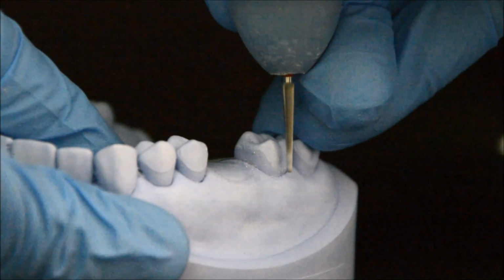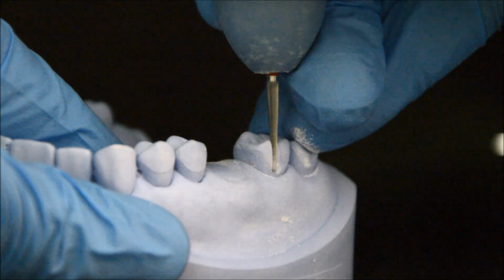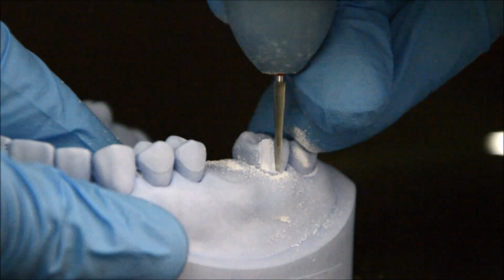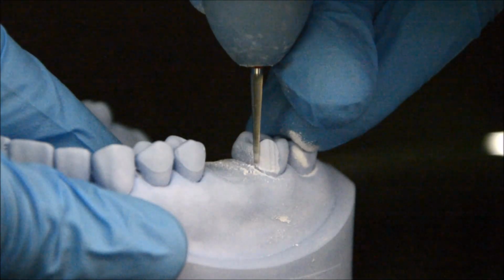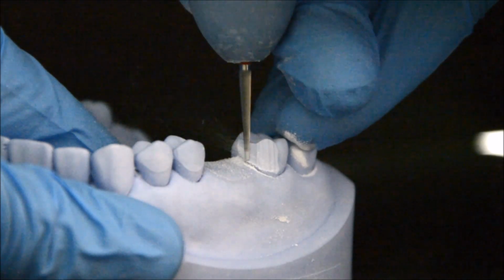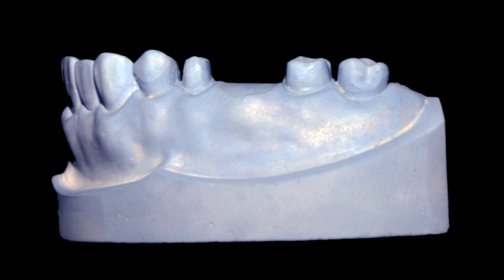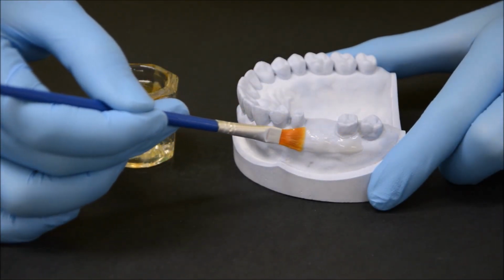The abutment teeth on the cast are then trimmed using a low-speed handpiece and a thin burr. This provides us with the tissue surface form. Minimal preparation is done all around, which should be less than the anticipated preparation in the oral cavity. The mold is checked for clearance. Separating medium is applied on the cast and left to dry.